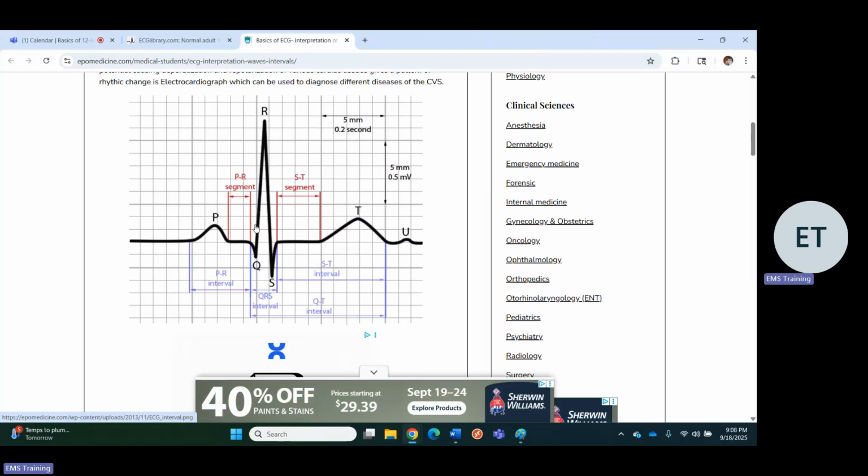What you will end up doing is identifying A, B, and C at the same time. Or you'll look at it and you'll just start identifying things that pop out easier. So you can get to a diagnosis quicker the more you practice, but you have to do A, B, C, D, E, F, G. And then every single time, even if you do really, really hard ones, I still do components of A, B, C, D, E, F, G, and I just stack them on top of each other.